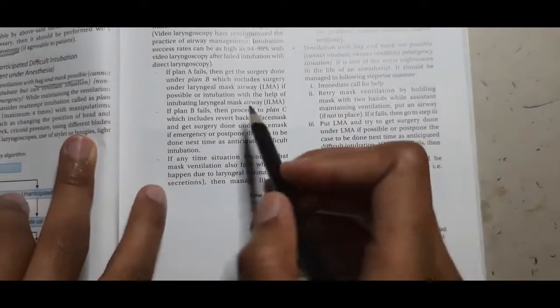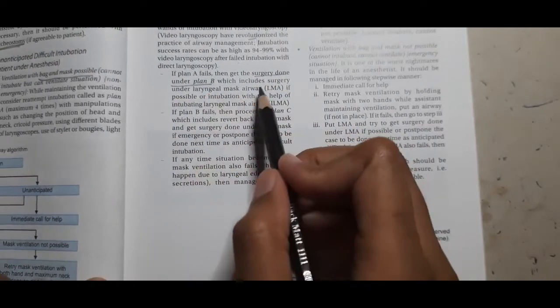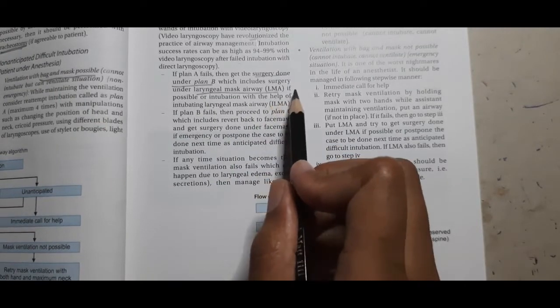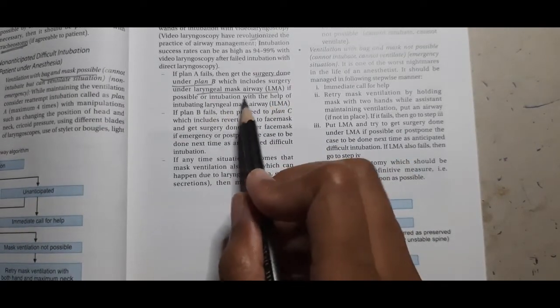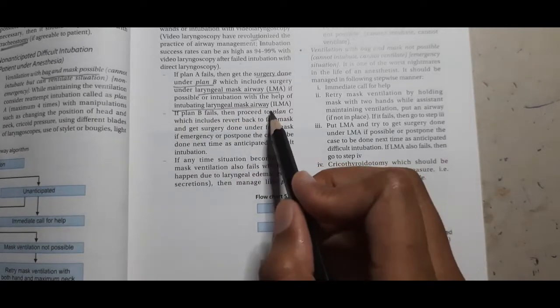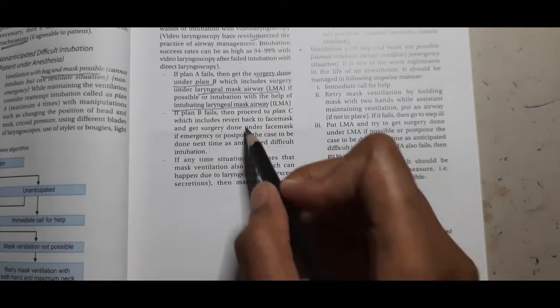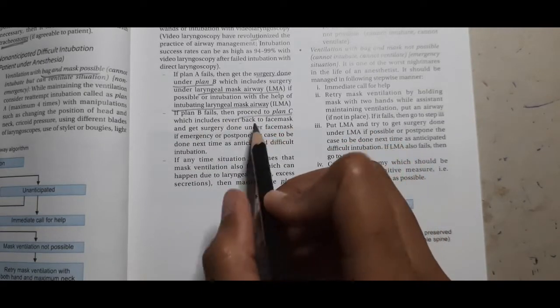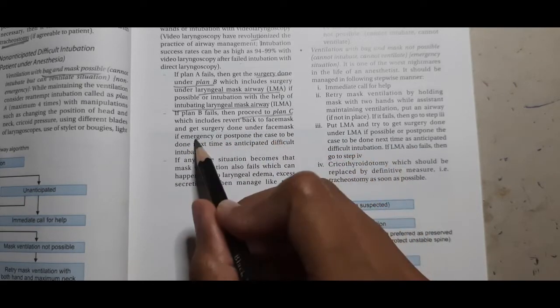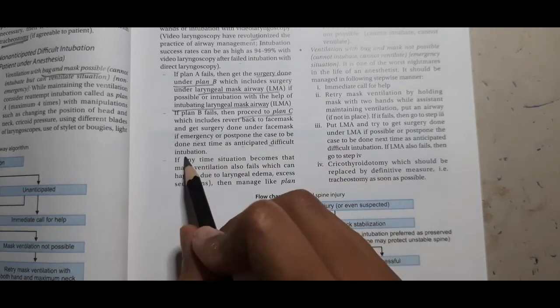If plan A fails, then surgery is done, which is under plan B. So this will include LMA if possible, or intubation with the help of an intubating laryngeal mask airway. If plan B also fails, then proceed to plan C, which is to revert back to face mask and get surgery done under face mask if emergency, or postpone the case to be done next time as an anticipated difficult intubation.